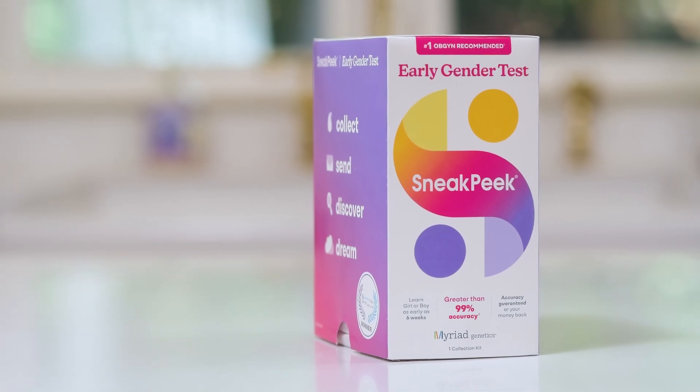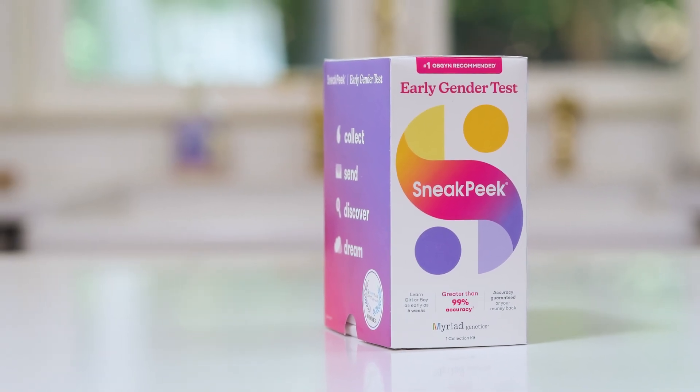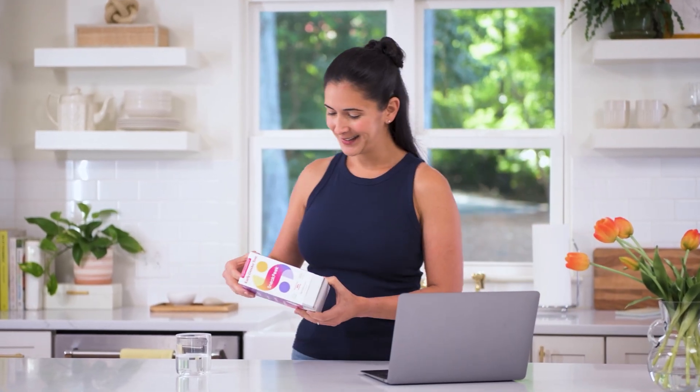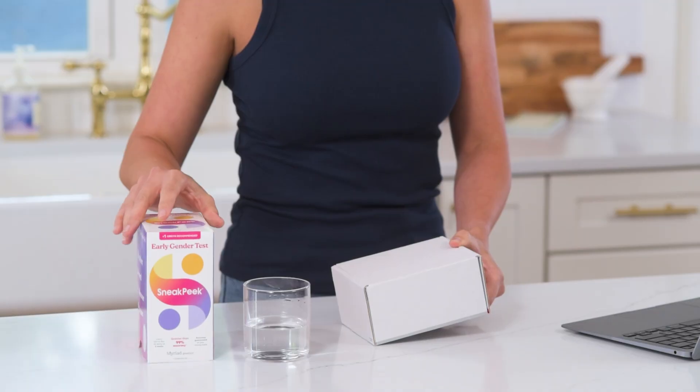Welcome to the Sneak Peek Early Gender Test, the earliest way to learn your baby's predicted sex. In this video, we'll show you how to take the Sneak Peek blood test to get the best results and reduce the chance of male DNA contamination.